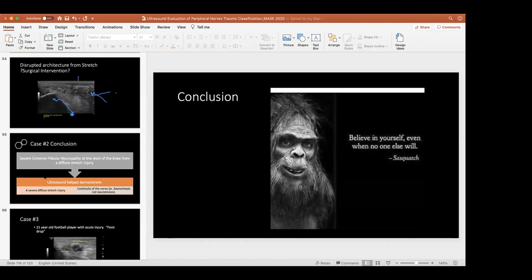In fact, I just want to echo Professor Jeff's comment, especially about how to use ultrasound to make a diagnosis of a nerve or fascia problem, or to assess prognostic factors, and then for the answer to Ravi. Ultrasound has the beauty of being dynamic. We cannot move that much under any other type of investigation, but with ultrasound you can ask the patient to move, and you can also move the patient. You can also scan dynamically by pressing down onto the structures you're looking at. And with ultrasound you also have two sides of the body. The gods provide us with both sides, and those have to be symmetrical.